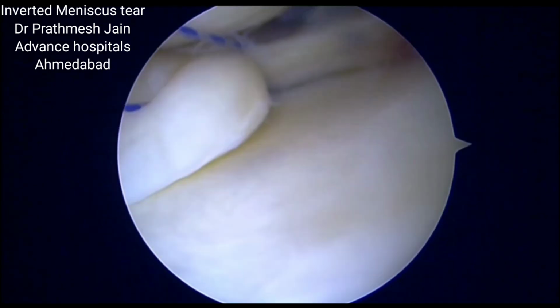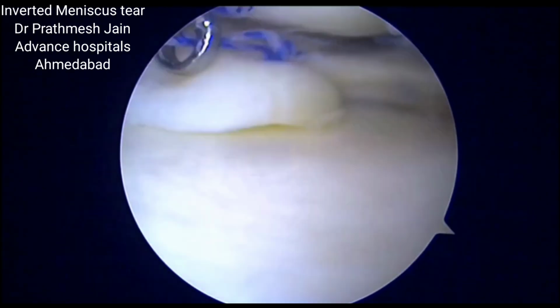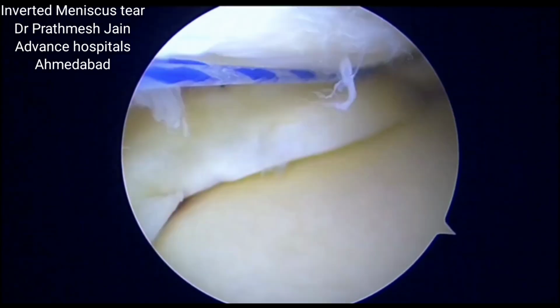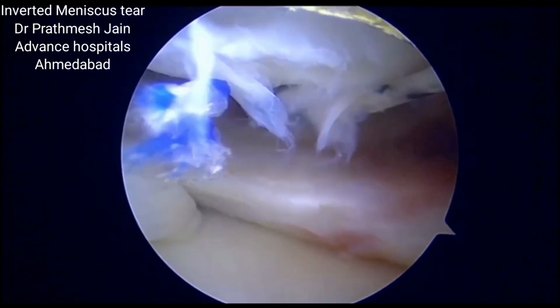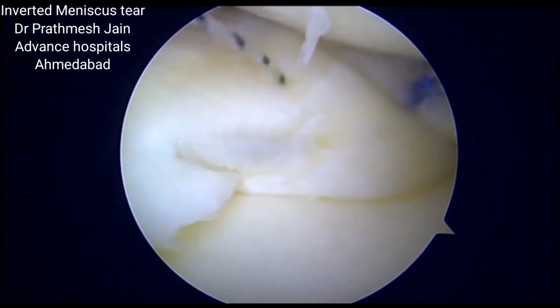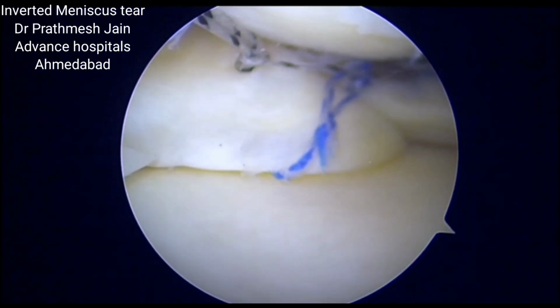And now we can see that even though the tear looked bad initially, once we repair the tear, the flap usually comes back very nicely into its position and will serve its function of the meniscus, taking meniscus stresses. So this is the final repair that we can restore with this sort of a repair.